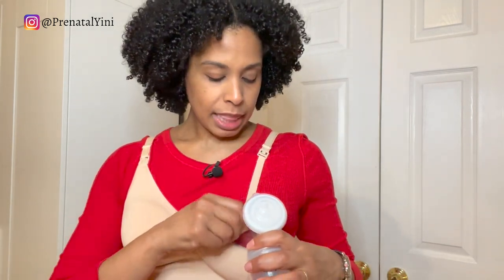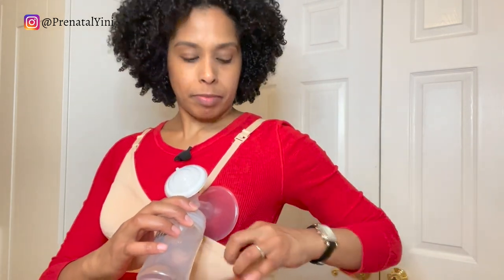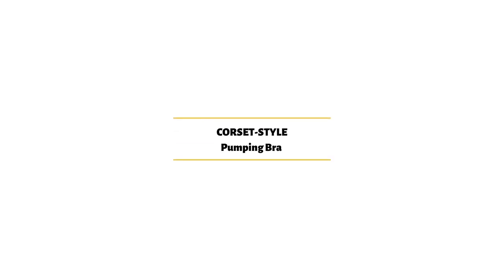The first hack: you can also use a traditional nursing bra as a pumping bra. You'll take this band, pull it in, adjust, position your flange, let go of the band, and then clip on the bra — and your flange will stay on. You can adjust the strap to make it longer if you need to position it lower, and then you can pump using a nursing bra.